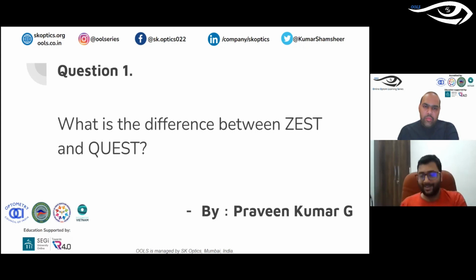But again, these are psychophysical tests. If the patient is super happy and had a coffee before the perimetry, they might do very well. If you call a patient at 4 o'clock in the evening and ask them to do a perimetry, they are going to give you poor results. And if you see a poor result, you ask the patient to come again the next morning and do it. So perimetry becomes really tough. It's a challenging task. People take it for granted, thinking oh, one perimetry done, but it's not like that. You have to wait to get really accurate results.